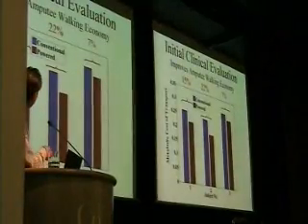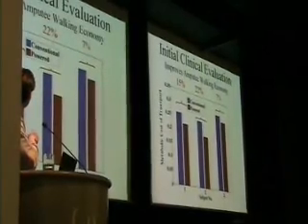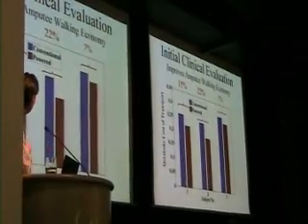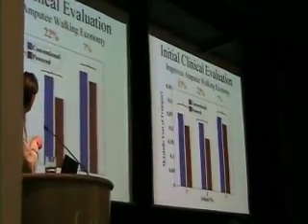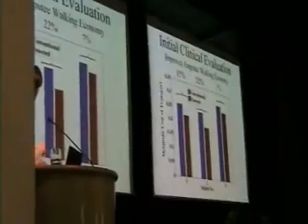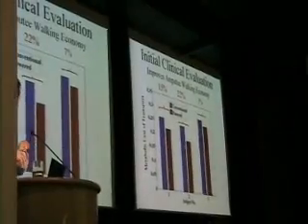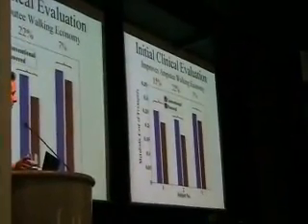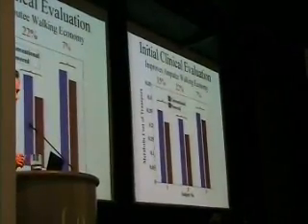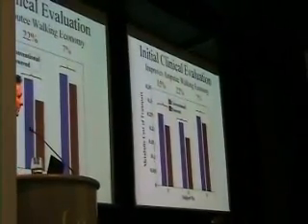So we measured the amount of energy used by this gentleman and other amputees using the robot. Here's metabolic cost, and here are three amputees that use the robotic system. The blue is a conventional prosthesis, and the red is the powered prosthesis. In this pilot study, we showed that we can lower metabolic cost using this new robotic system as compared to the conventional prosthesis. These numbers, the percent differences here, are very significant.